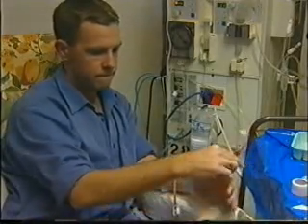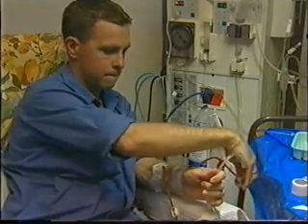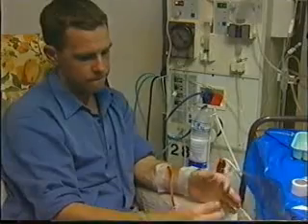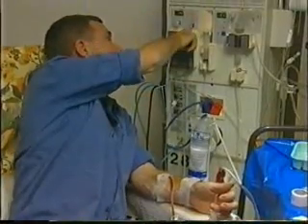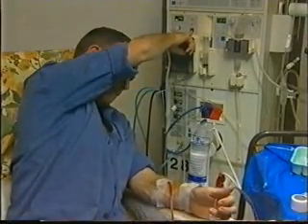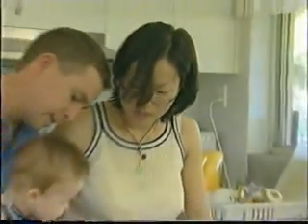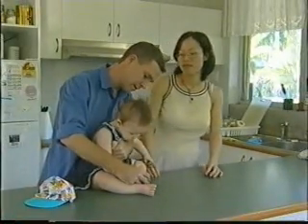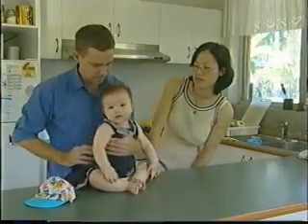He became self-care. When you decide to look after yourself at home, you must have a buddy or malpa with you. They have all the training, all the teaching, just like you. Your malpa can be anyone you choose, but they must train with you and be happy to be there whenever you do dialysis. Some people choose to have more than one malpa. Here is Mr. Harding talking about his malpa.